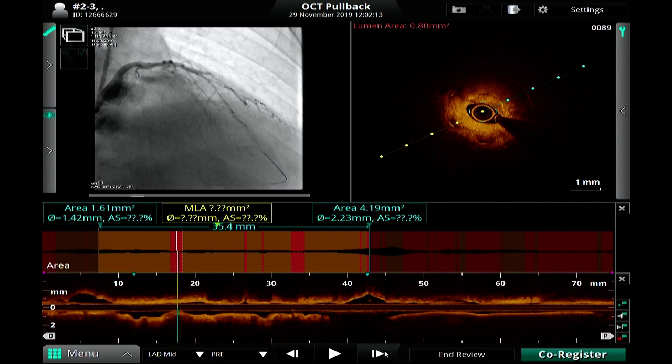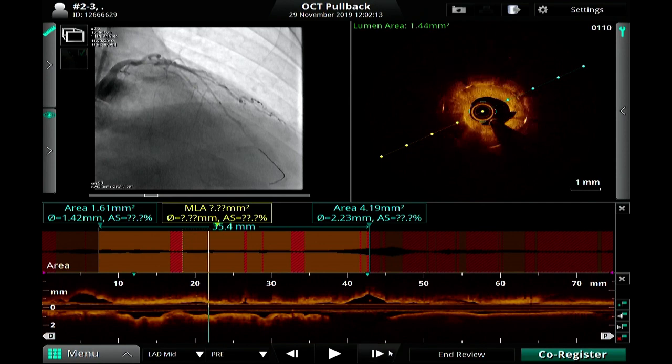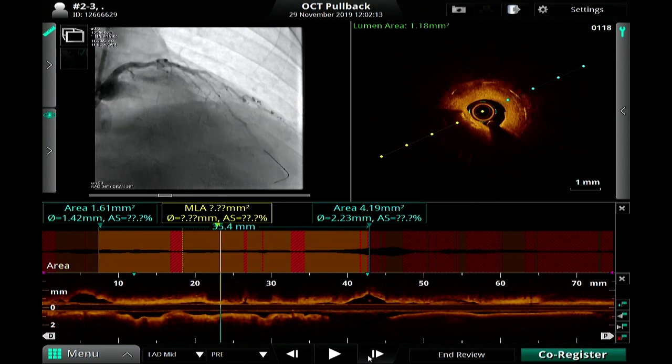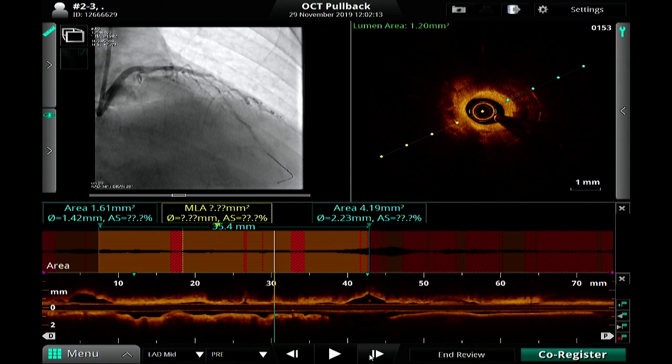Here you can see the well-bordered calcification with a crescentic shape at 10 to 2 o'clock. Next, here is diffuse neointima, and at 4 o'clock there is also some calcification. If we move proximally, there is some diffuse lipid, a diffuse lipid plaque. That means neoatherosclerosis, with lipid inside the stent, newly developed atherosclerosis inside the stent.